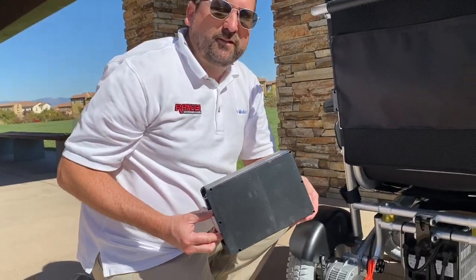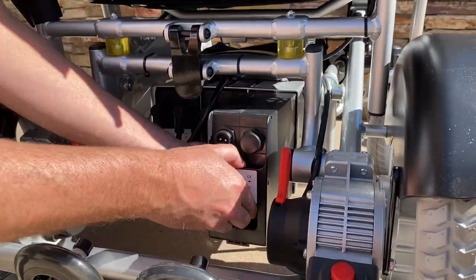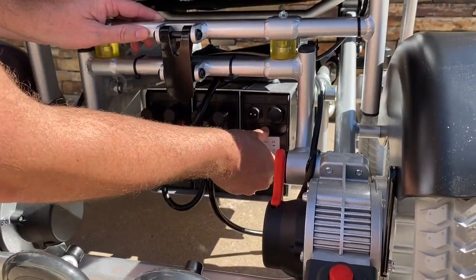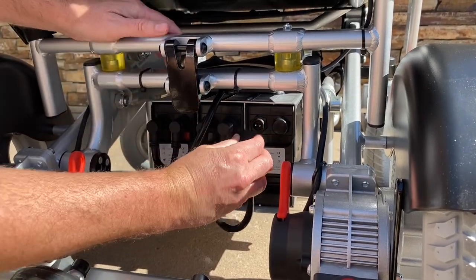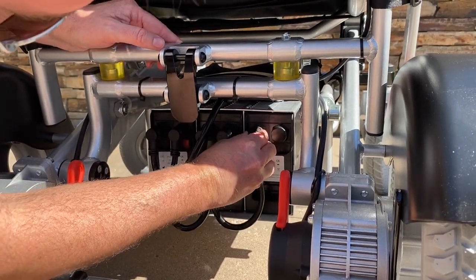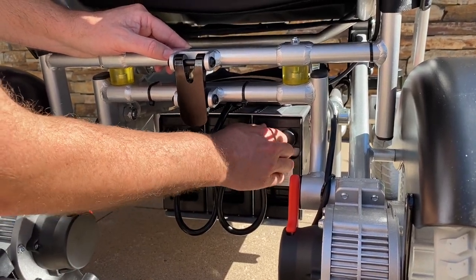Now I'm going to install the battery. To do so, simply slide it into the slot. Push it all the way in until you hear the click — that click means it's locked. Then take the cable, line up the prongs, put it in and twist, and there you go.